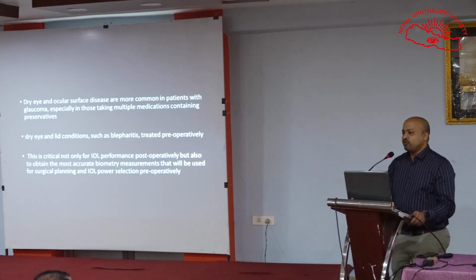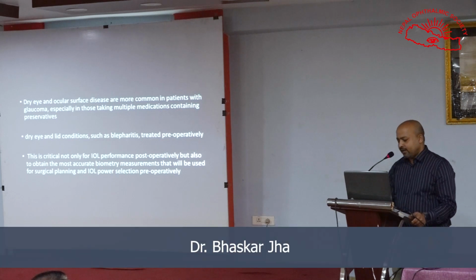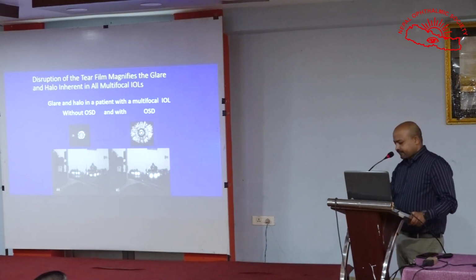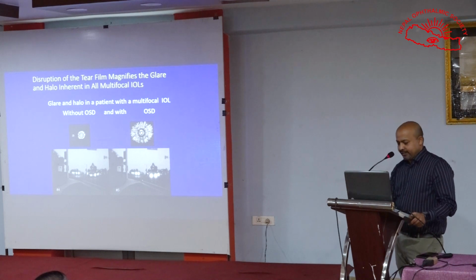So this is to be very well identified because it also affects the pre-op measurement of the IOL powers and also the performance of the lens post-operatively because of the reflection of the light caused by poor tear films. So this is just an image showing the patient with glares and halos with OSD and without OSD.